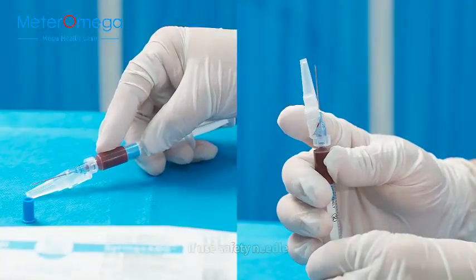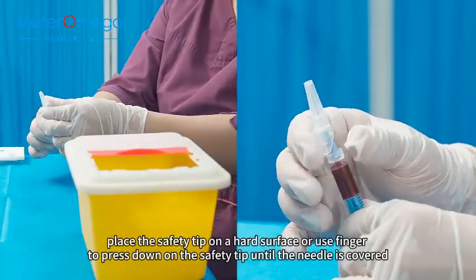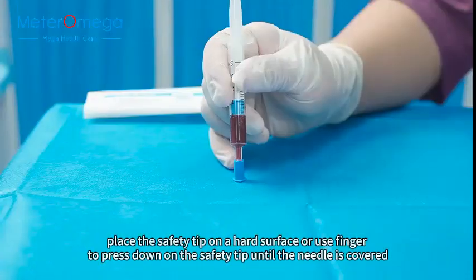If using a safety needle, place the safety tip on a hard surface or use a finger to press down on the safety tip until the needle is covered.